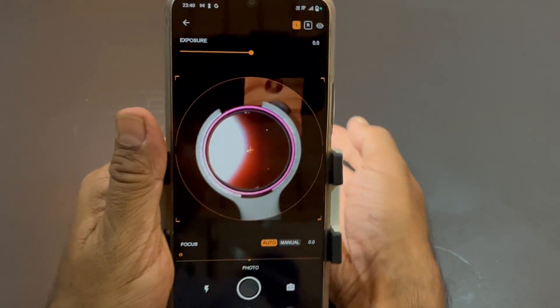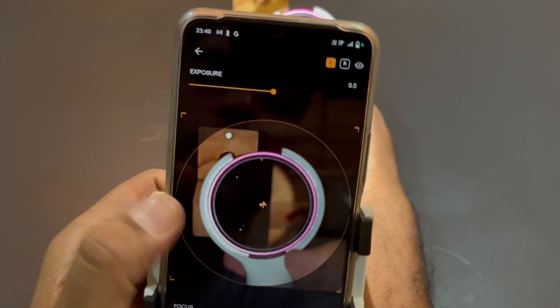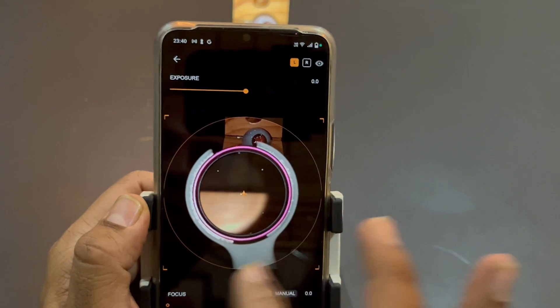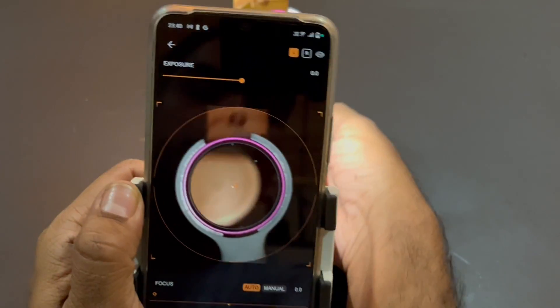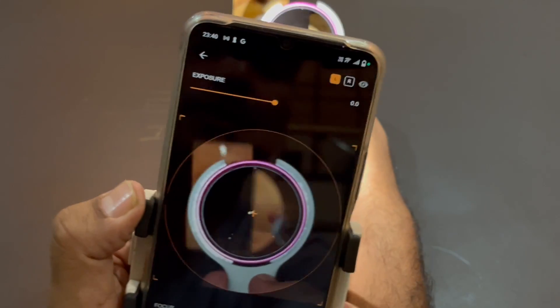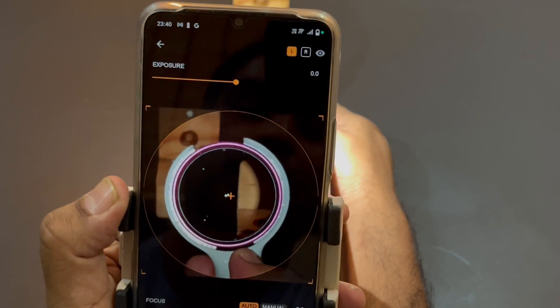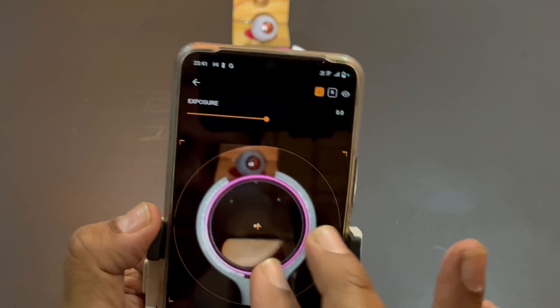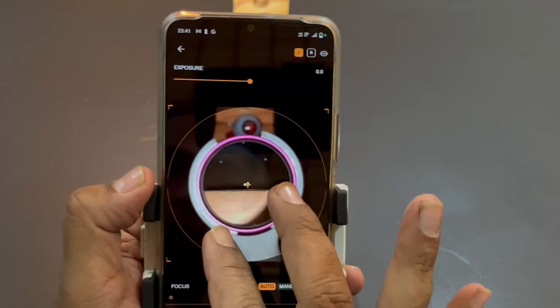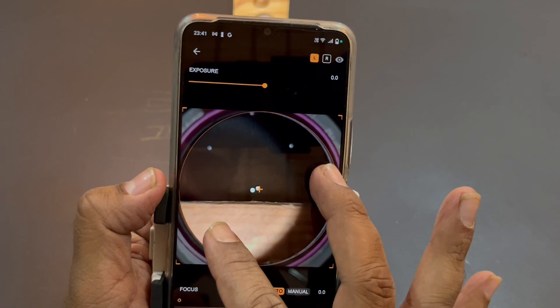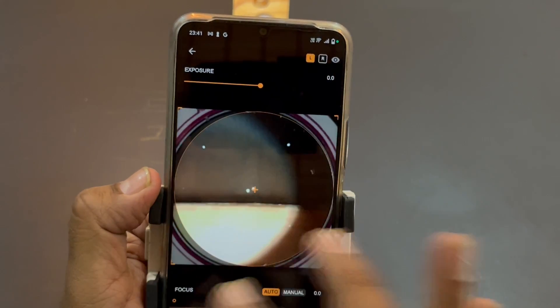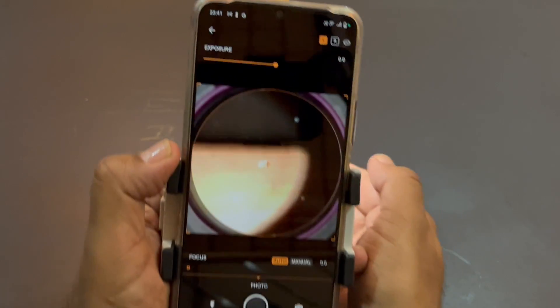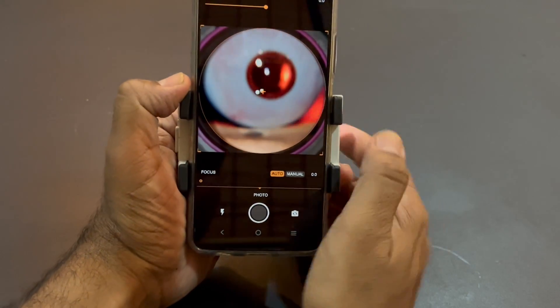This is an important point: different phones have different cameras. Your aim is to bring the image right into the center of the orange circle. To do that you may need to move left, right, up, or down. Once the image is centered, slowly zoom in and keep zooming until the rim of the lens is hidden — that way your pictures will look much more professional.